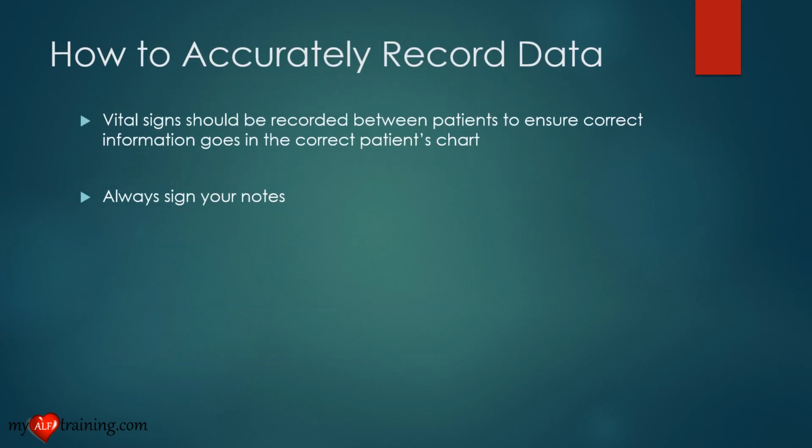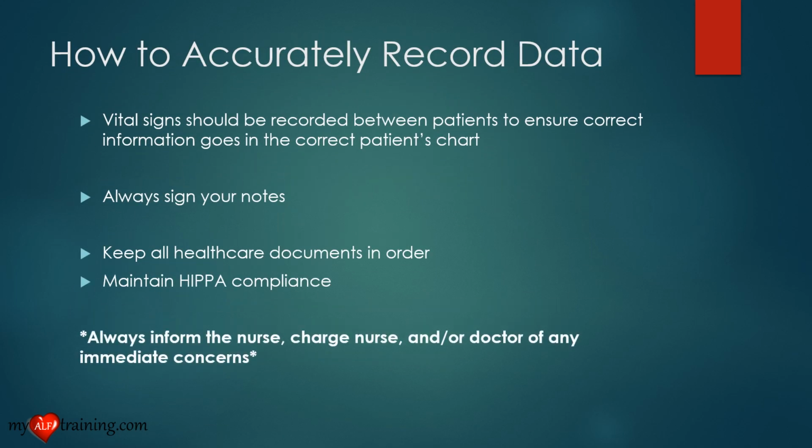Vital signs should always be recorded between patients to ensure the correct vital signs go with the correct patient's chart. We're always going to sign our notes with our name, and we're going to keep healthcare documents in order. Always remember to maintain HIPAA compliance at all times when concerning the patient's medical record. And always, always, always inform the nurse, the charge nurse, and or the doctor if there's any immediate concern when taking your vital signs.